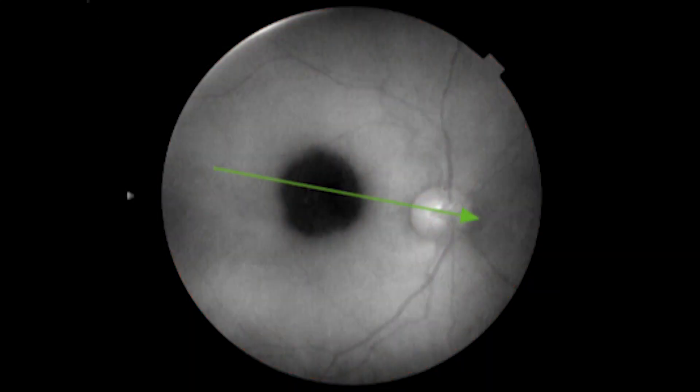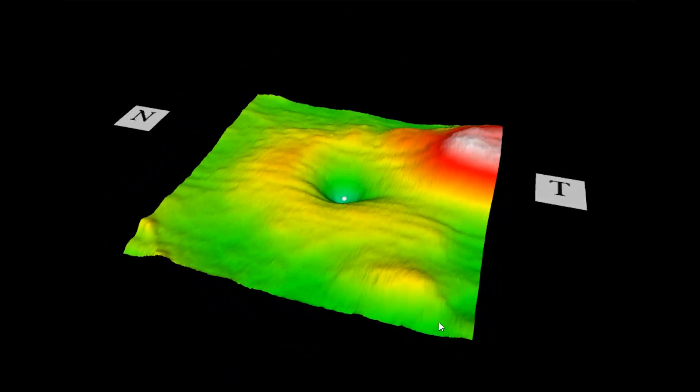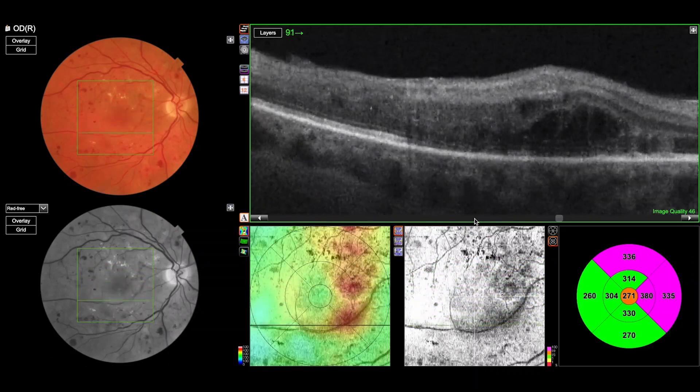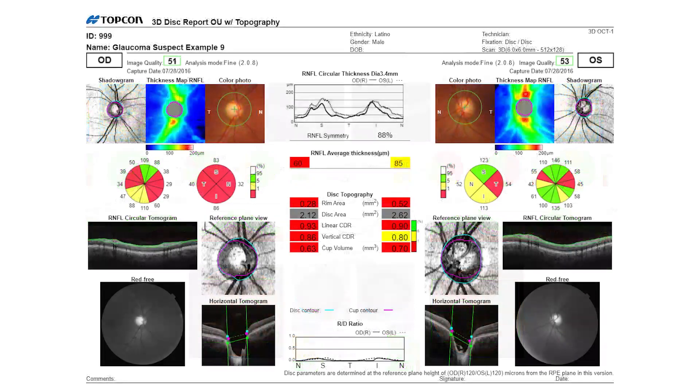The quality of the images with the Maestro 2 are extremely high. I can see both a 3D reconstruction of the surface of the macula, but also there's the ability to actually see individual cuts at a very high resolution and scroll through the image. A great advantage of the machine is the fact that you can get an OCT and also a digital photograph.